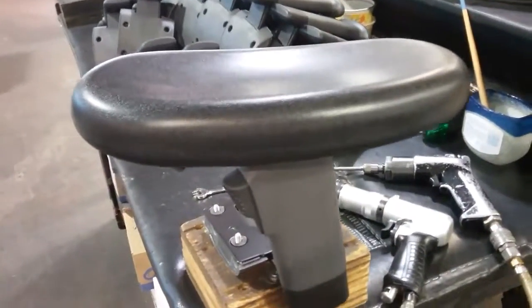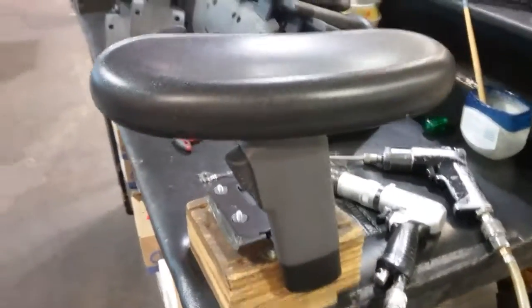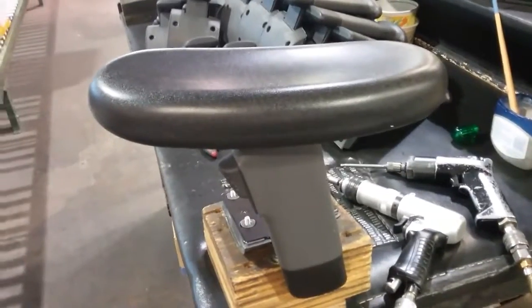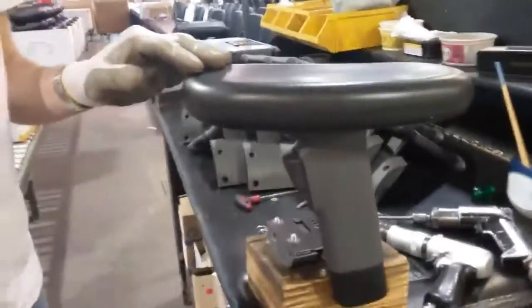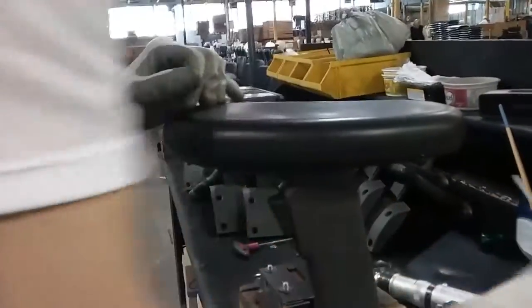Hey everybody, we're going to show you today how to access the internal hardware on the 3D arm by Nightingale. Underneath the arm you're going to have two screws that you're going to want to take out. You're going to find them at the front of the arm and also at the back of the arm. And now we're going to show you just simply how you take your power drill and remove those two screws to begin with.